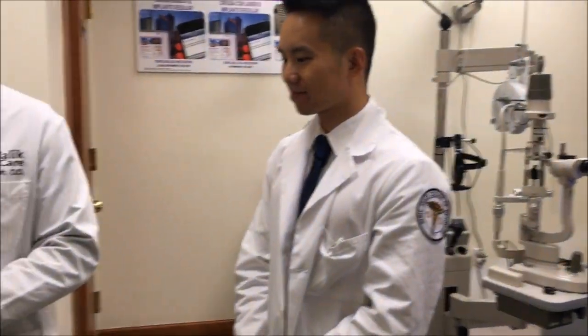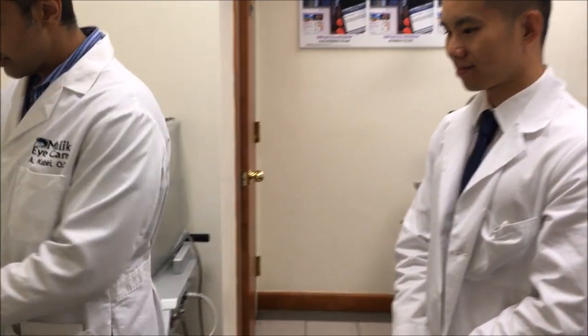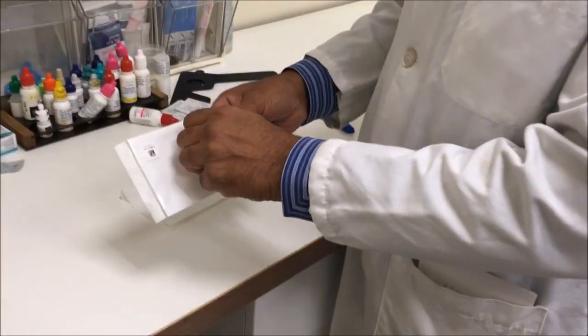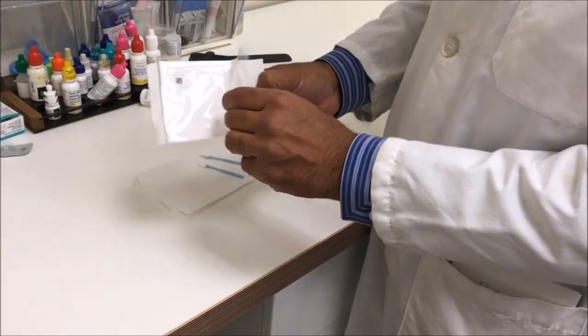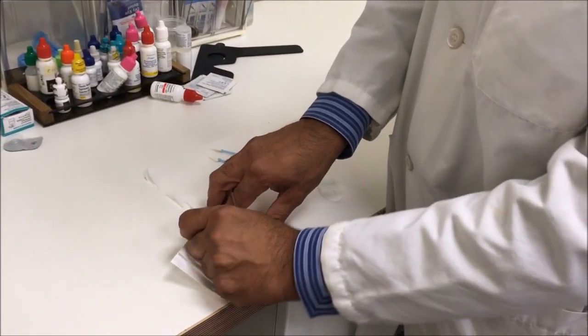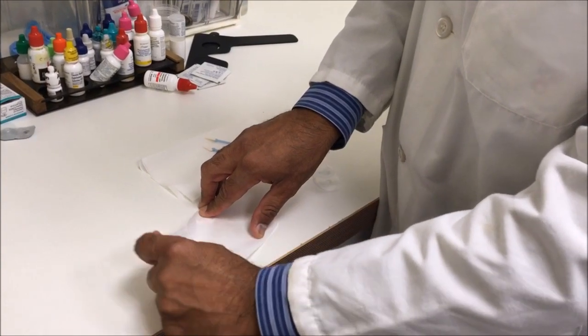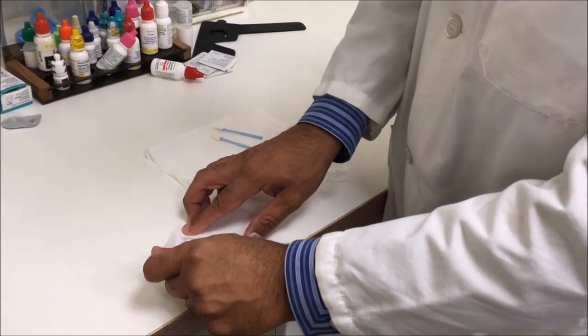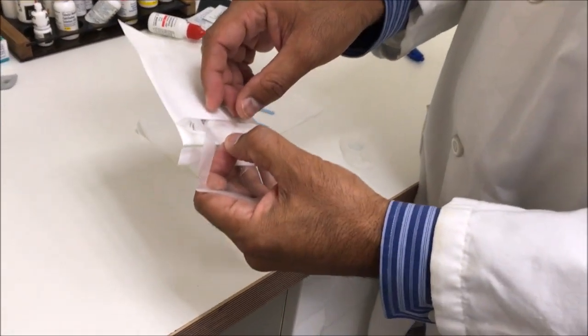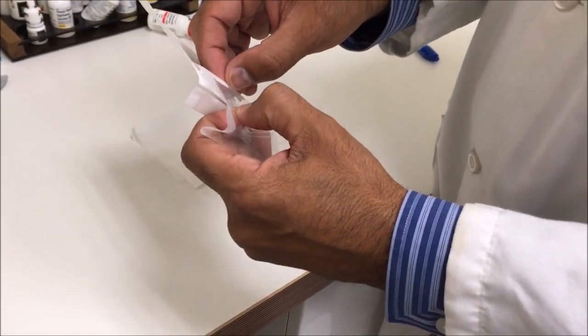I have as my assistant today Wex Wong, Suni Fourth Year Extern, so he and I are going to do this together. We're going to open this. You do want to be careful when you open these — open them slowly. The product is very very light and should a light breeze catch it, you could lose it. The side that's down in the package stays down on the cornea.